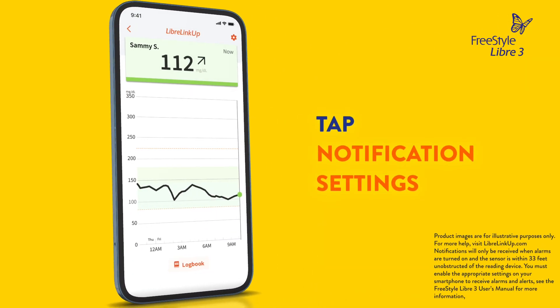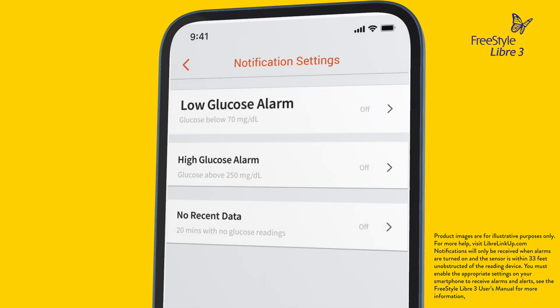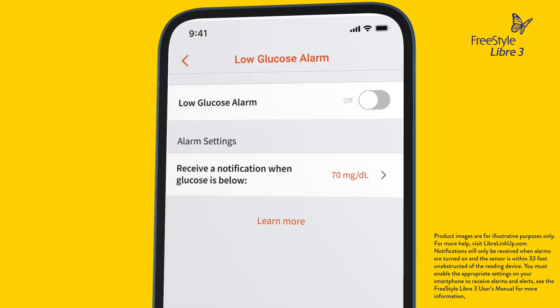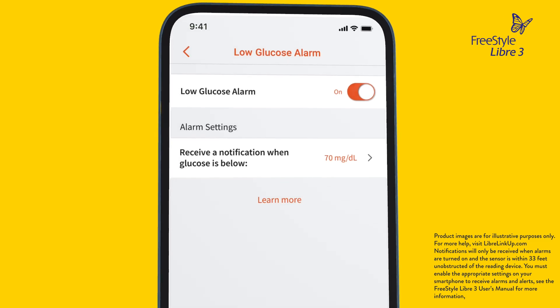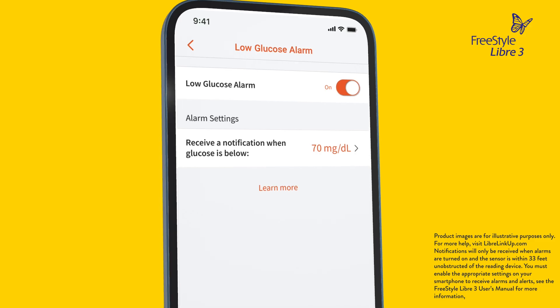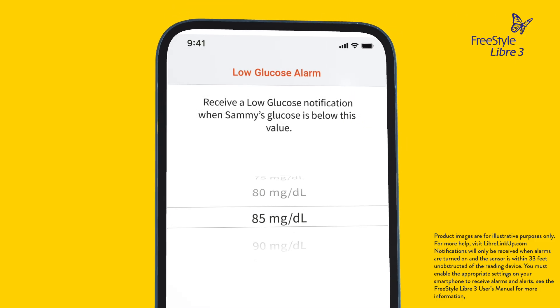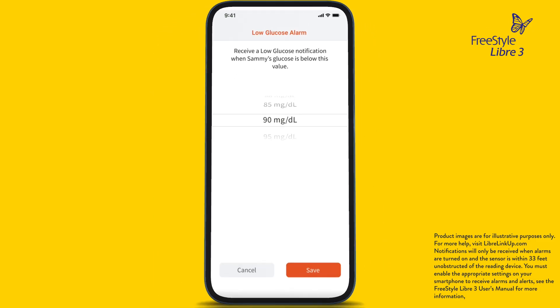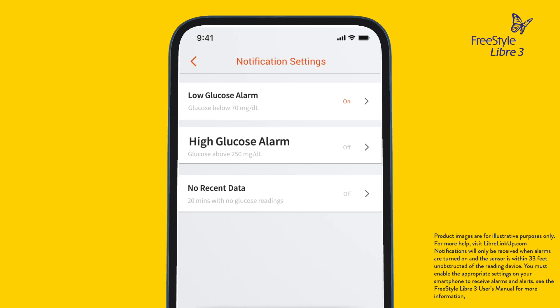To set or customize alarms on the LibreLinkUp app, tap Notification Settings on the home screen — that's the gear in the upper right corner. Let's start with the low glucose alarm. Tap the slider to turn the alarm on. If the alarm is on, you'll be notified the minute your connection's glucose crosses the alarm level you set. If you want to change this value, scroll and choose a value between 60 and 100, then tap Save. Follow the same steps to set a high glucose alarm. You can also set a no recent data alarm.